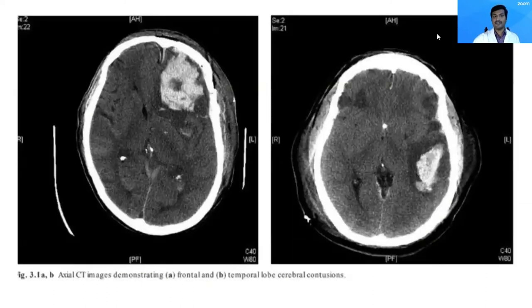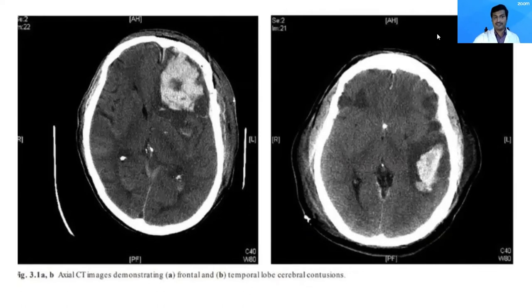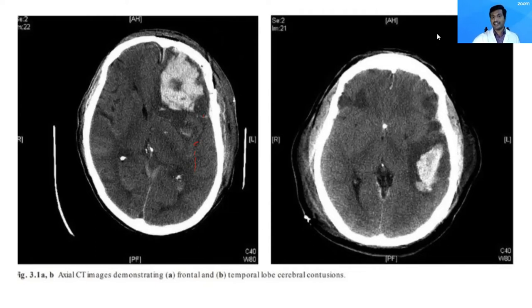This is a patient with frontal contusion — the volume appears to be more than 30 cc. You can see the midline shift and the ipsilateral cortical sulci being obliterated. Similarly, this is a patient with temporal contusion where the volume is more than 20 cc. The sylvian fissure is obliterated, the ventricles are compressed and not visible. Obviously, intracranial pressure is very high in both these patients.